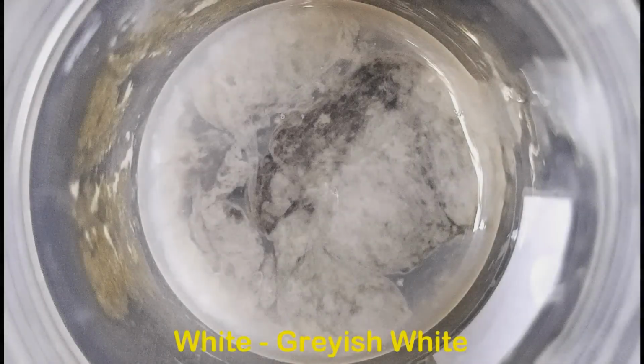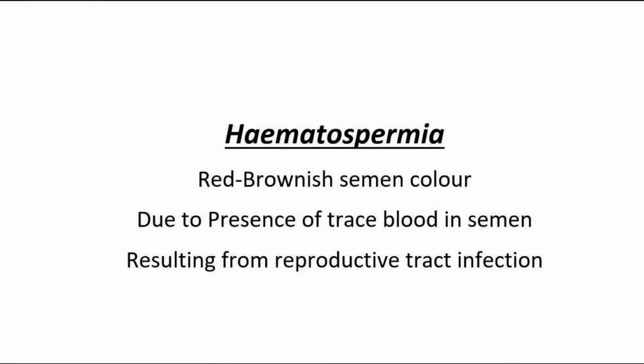The normal color of human semen is white to grayish-white. Semen color is influenced by diet, age, medication, and certain underlying medical conditions. Red to brownish semen color indicates the presence of blood, a condition called hematospermia. This could be a result of infection in the reproductive tract.